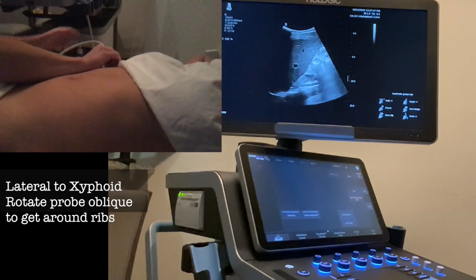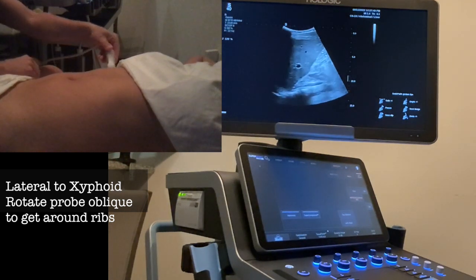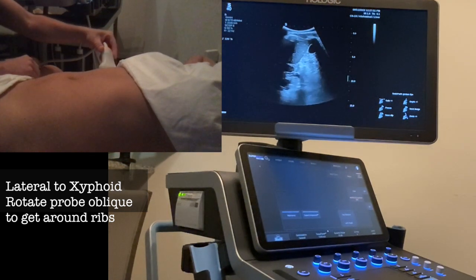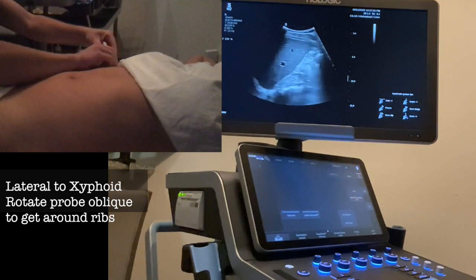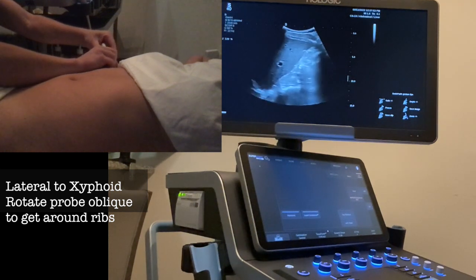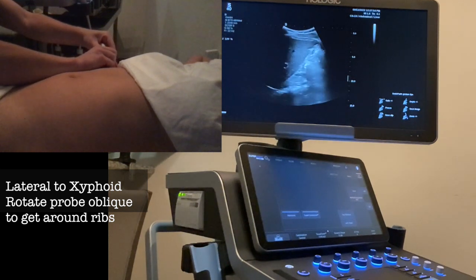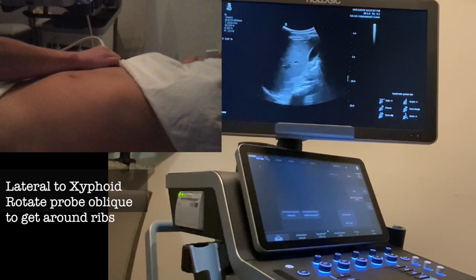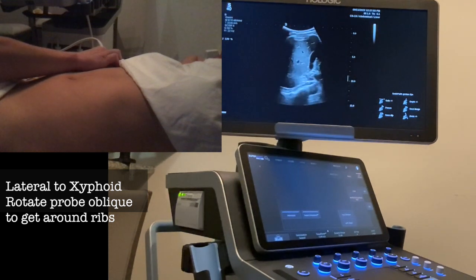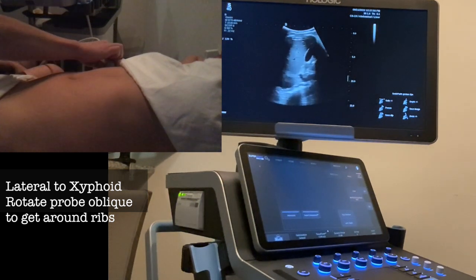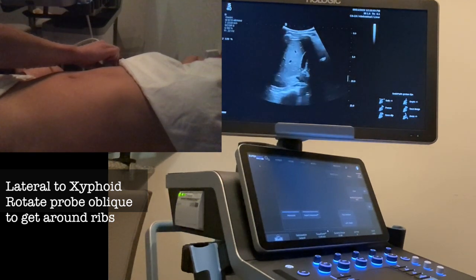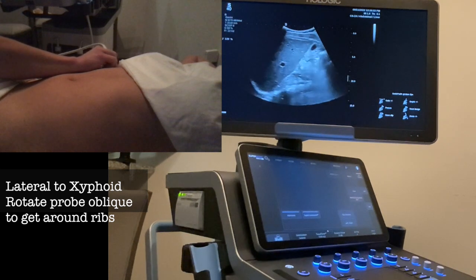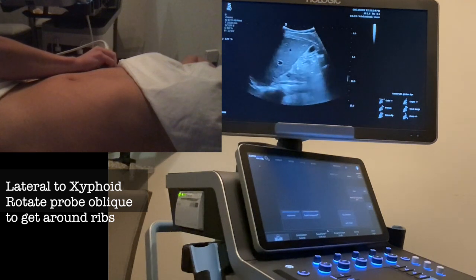I'm going to turn my probe oblique. Here's where I started — turning oblique — and as you can see on the image, what that does is it gets rid of the rib shadowing. If I'm here and I turn oblique, you'll see those ribs disappear in the image.